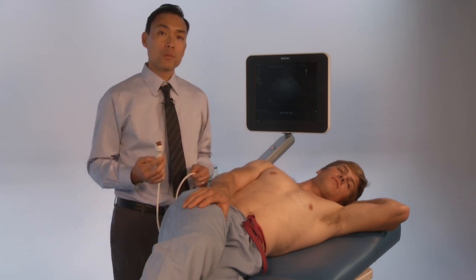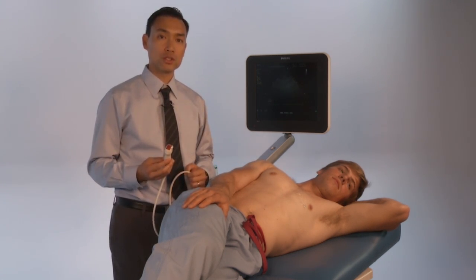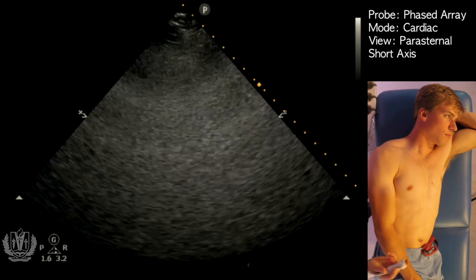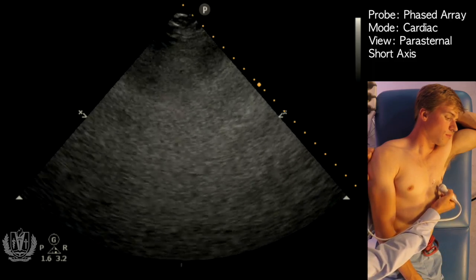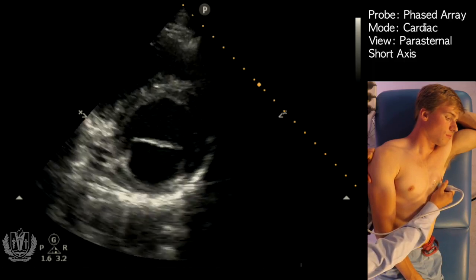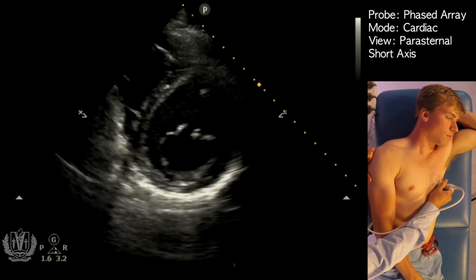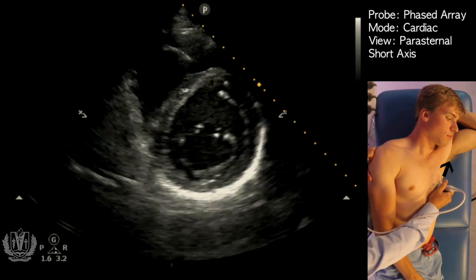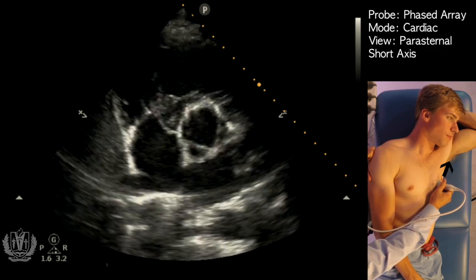This is the apical four-chamber view of the cardiac ultrasound. You can use the short axis view from the patient's short axis to help you obtain your apical four-chamber view.